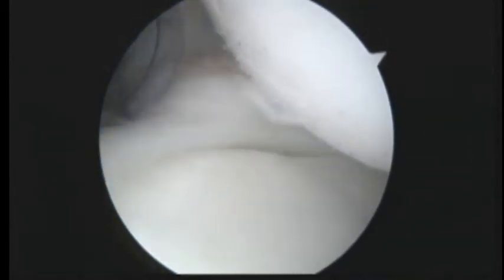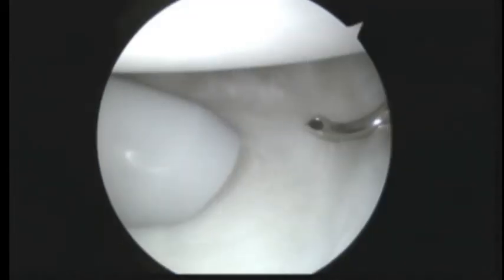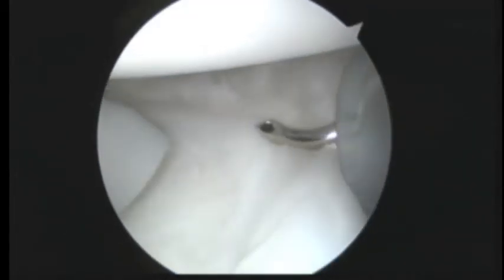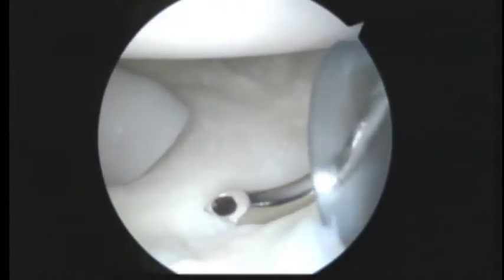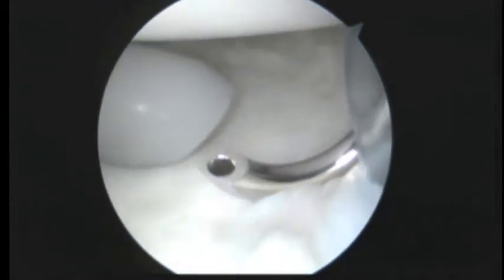Okay, pause please. Okay, now we're looking at the front of the shoulder. We've already roughened up the capsule a bit. It's interesting in that it doesn't really, on the face of it, look that loose, but it certainly was clinically, and that's why we're going to tighten this ligament here. We're going to reach in with our hook and make a pass through about here.